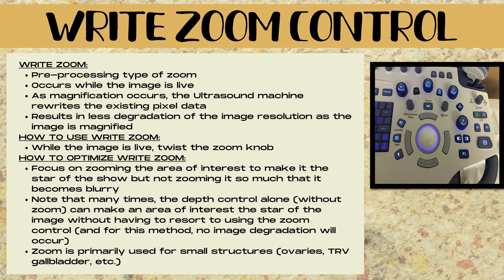To optimize write zoom, you want to focus on zooming the area of interest to make it the star of the show, but not zooming so much that it becomes blurry. Note that in many cases, the depth control alone — without zoom — can make an area of interest the star of the image without resorting to the zoom control, and no image degradation will occur while using depth. Zoom is primarily used for small structures such as ovaries or the transverse gallbladder, but always be wary that the more you zoom, the less image resolution and the more blurriness you'll have.